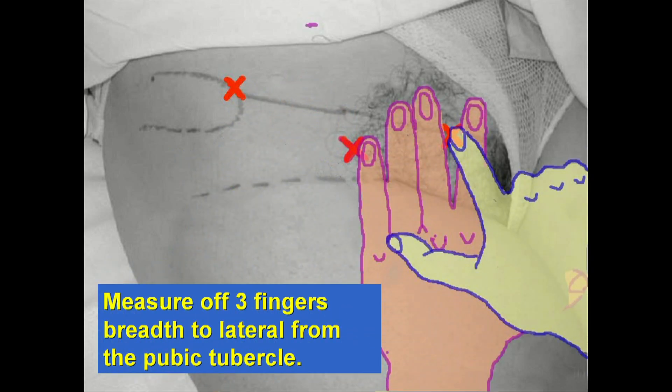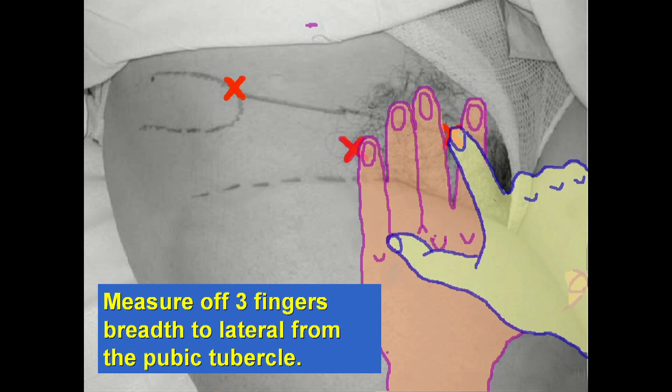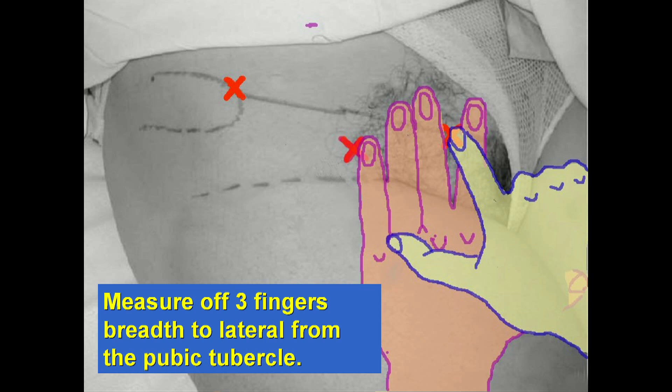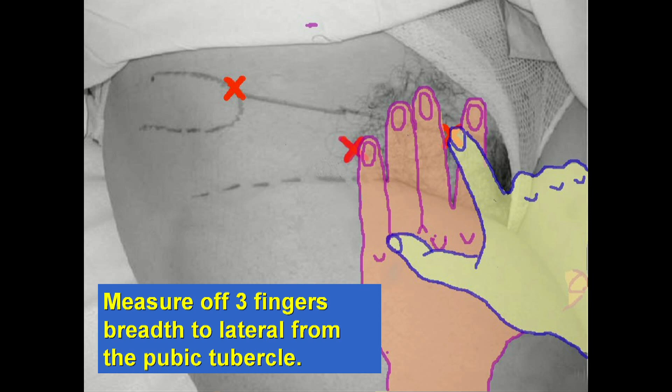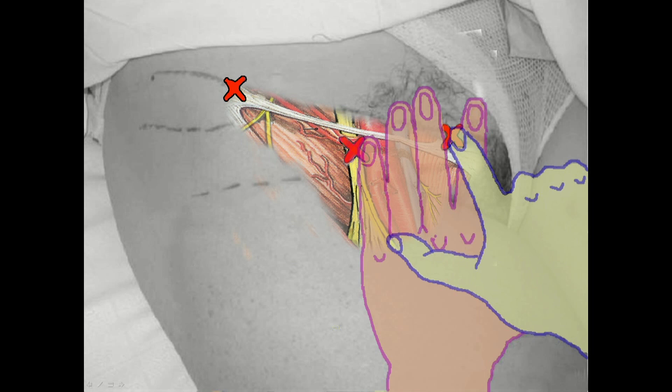Next, place a finger of one hand onto the pubic tubercle. Pushing hard through the pubic fat and onto the tubercle causes the patient a deep visceral discomfort, which confirms the accuracy of the bony point identified. Then measure off a distance of three fingers lateral from the finger on the pubic tubercle. Lastly, if you mark a spot lateral to the three fingers and two centimeters below the inguinal ligament, it should coincide with the first point marked. If the two points do not coincide, review the bony landmarks again until the points do coincide.